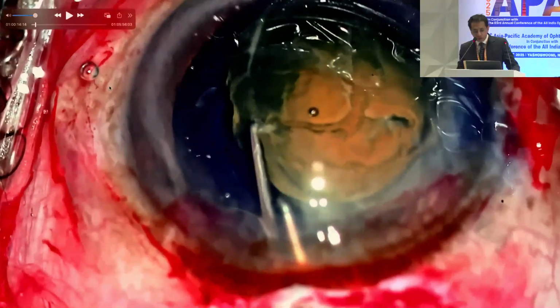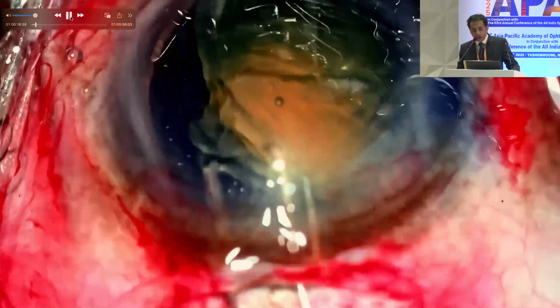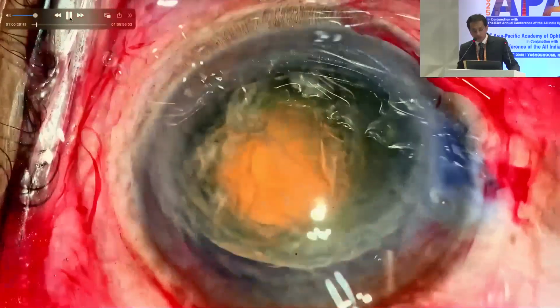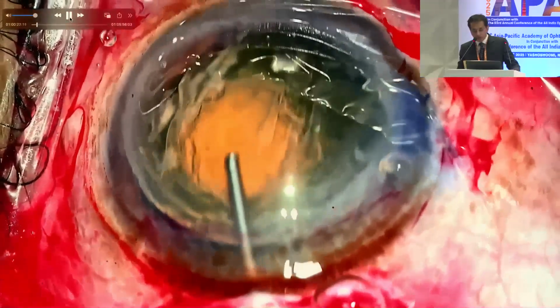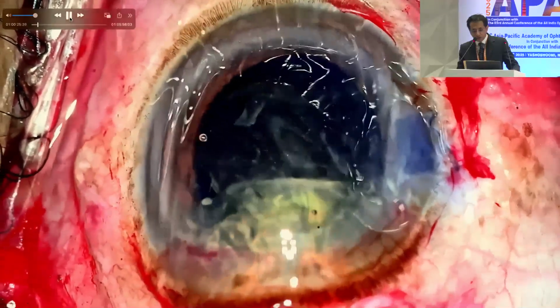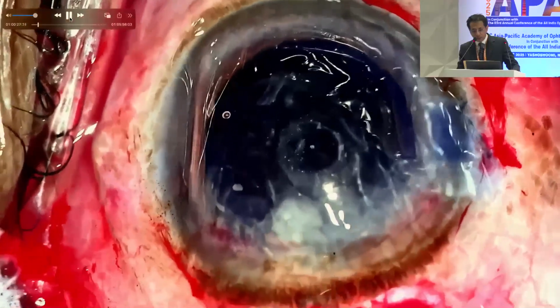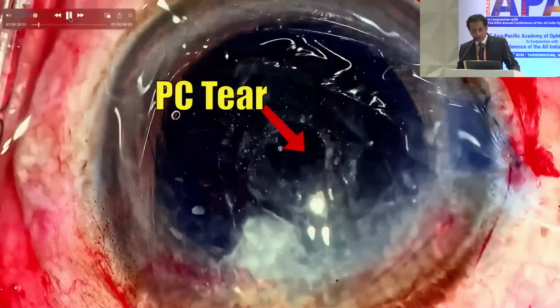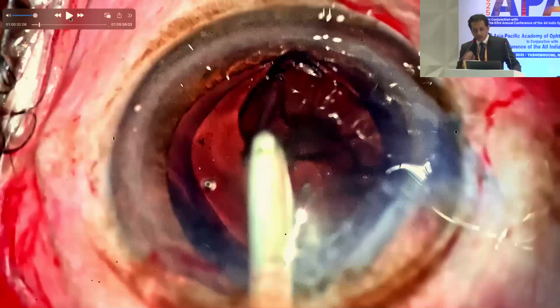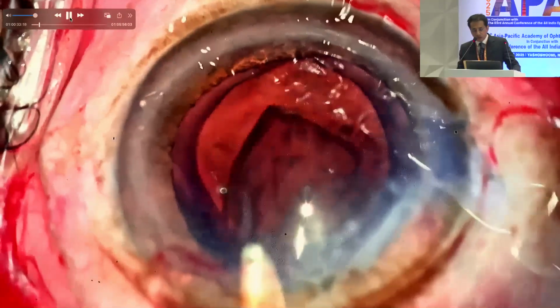Because we have a longer exposure in the subincisional area, maneuvering the nucleus out of the bag is relatively easy. We don't do hydrodissection using two Sinskey hooks. It is just wheeled out of the bag. When we pull the nucleus out, there is a momentary shallowing of the chamber, and this is when the posterior capsular tear can happen. This is what I experienced initially. That momentary shallowing is what causes the posterior capsular tear.